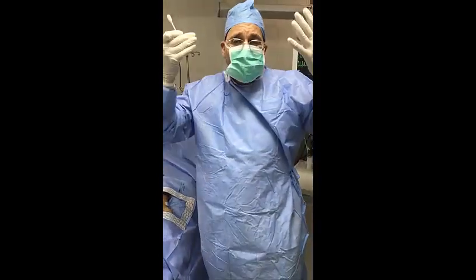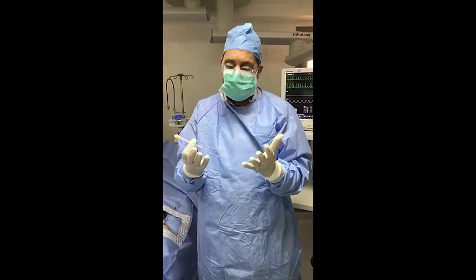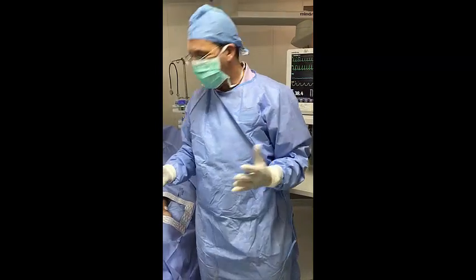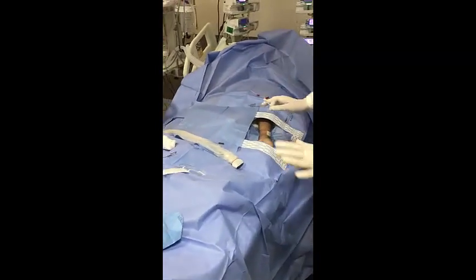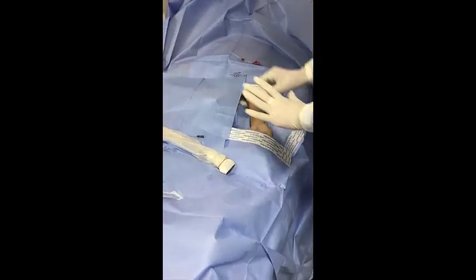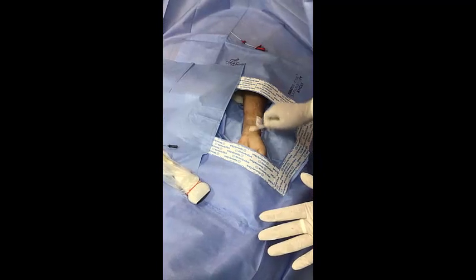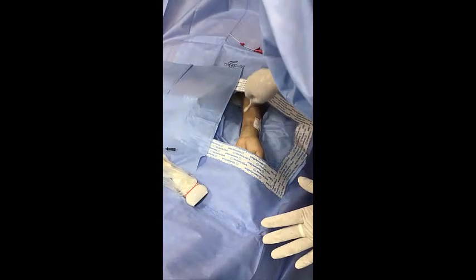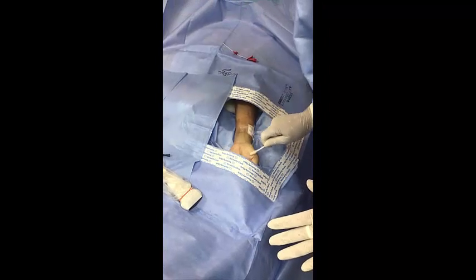First of all, you should be fully covered from head to toe — head cover, face mask, gloves, gown — all should be sterile. The patient should be fully covered as well. I have already sterilized the patient, but I will now re-sterilize with chlorhexidine all the area of the arterial line insertion.